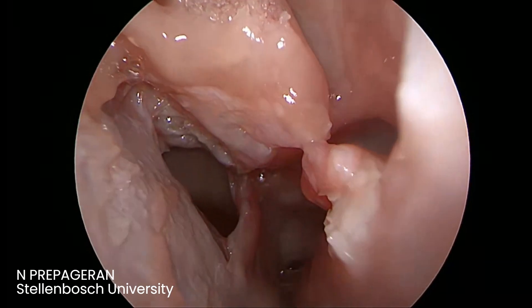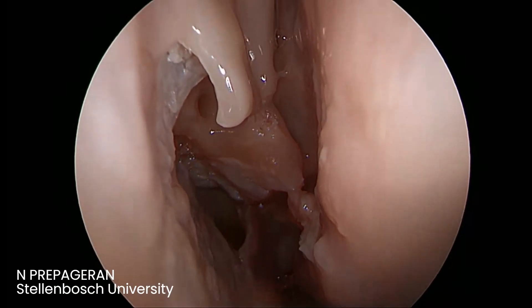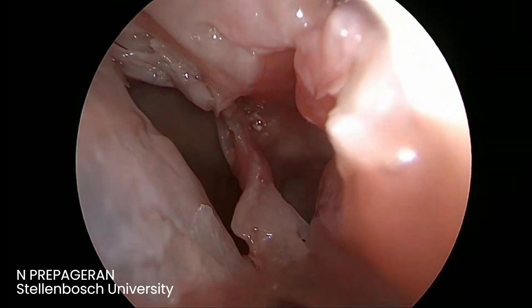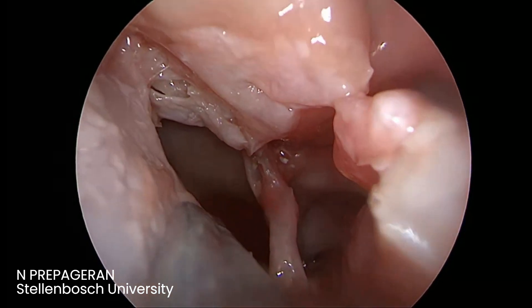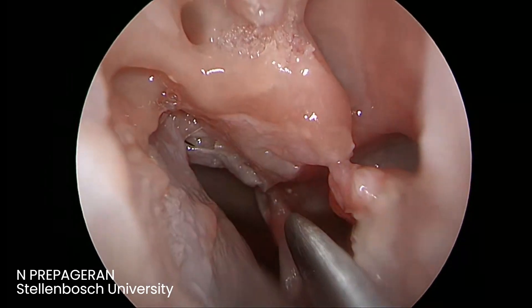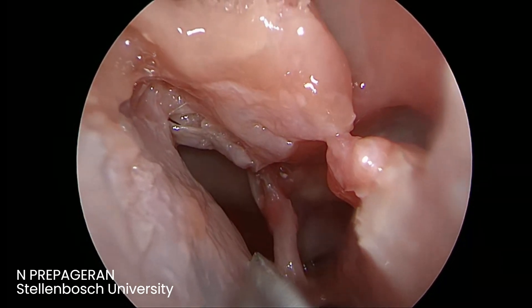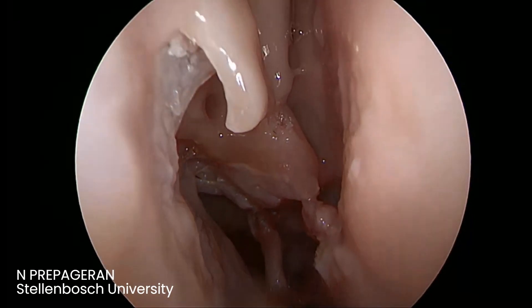How large does the maxillary sinus need to be open? In both situations this is more than adequate — you are going to visualize all you need for the function. Get it to be larger with the freer's elevator. Dissect down a little bit, flip it open directly, backwards. This is more than enough. The idea is not to touch the mucociliary clearance around it — just make a window. Similarly flip it open; the mucociliary clearance is still intact. We will do a larger partial middle meatal antrostomy, and also a middle meatal antrostomy for the next module. Next is to go into the bulla — the bulla, second gate.